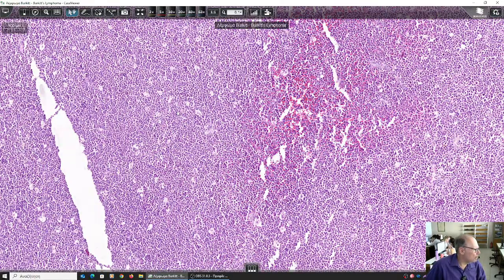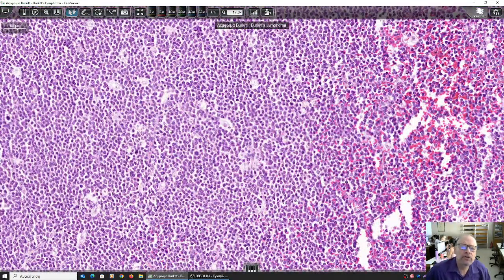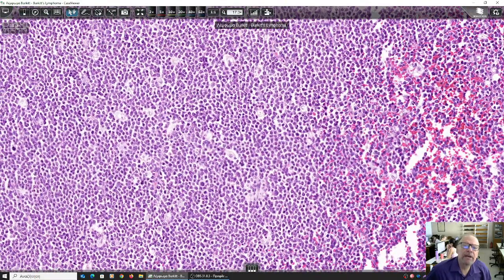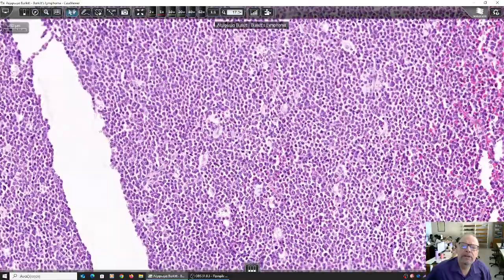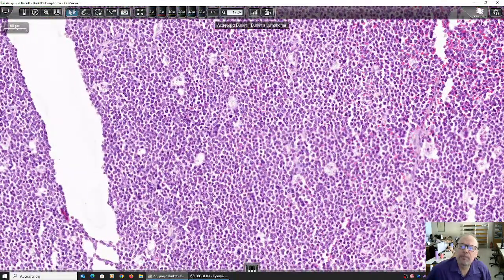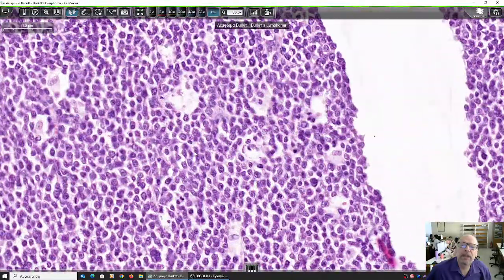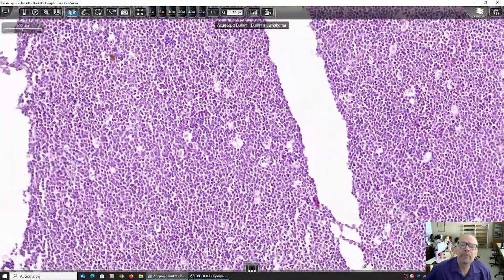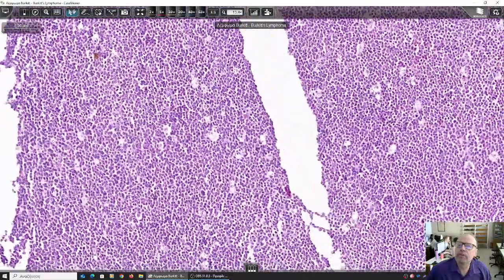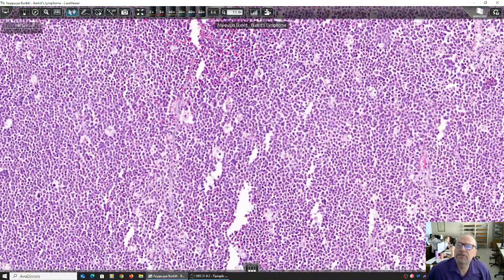Let's have a closer look at them. Could they be Hodgkin lymphoma cells? They appear somehow like lacunar cells. However, there is a morphologic feature in these cells which makes them innocent. What is that? Let me check some of them. Could they be Hodgkin lymphoma cells?